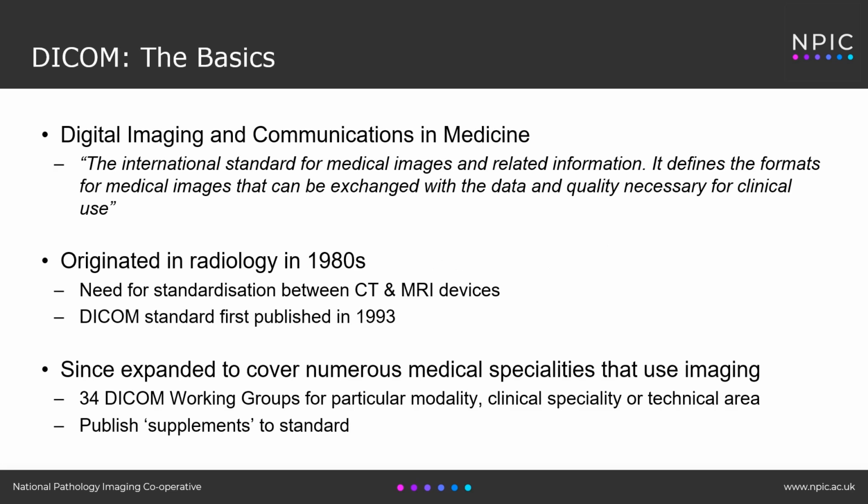So let's start with the basics of DICOM. The term DICOM stands for Digital Imaging and Communications in Medicine, and the definition from the DICOM website is the international standard for medical images and related information. It defines the formats for medical images that can be exchanged with the data and quality necessary for clinical use. DICOM originated in radiology in the 1980s.